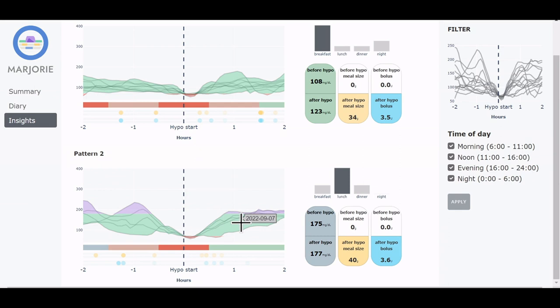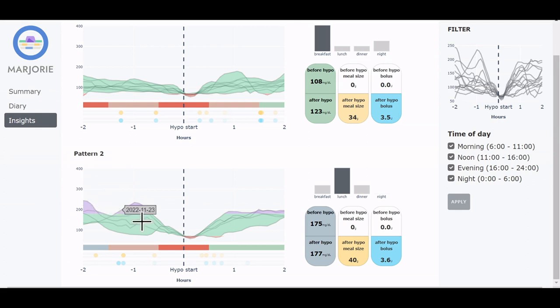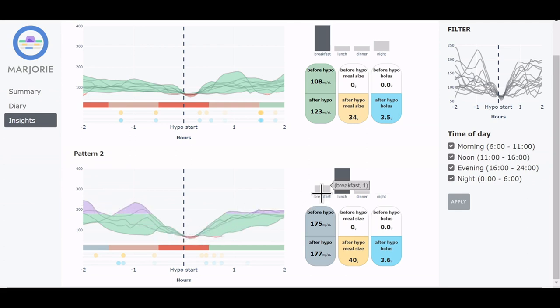The conclusion that can be drawn from using Marjorie is that the patient's therapy quality is generally okay, but the hypoglycemia periods can be reduced. So possible considerations to improve the therapy are not to eat when the glucose levels are already high in the evening and to inject the bolus insulin with adequate time before meal. This avoids entering this loop of high blood sugar, too much correction insulin resulting in low blood sugar, and then high blood sugar once again due to binge eating.